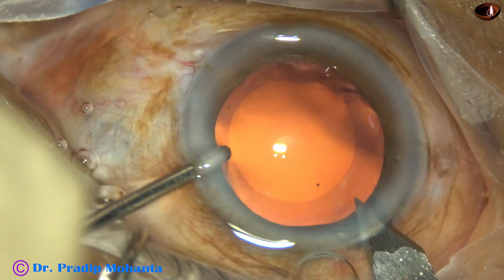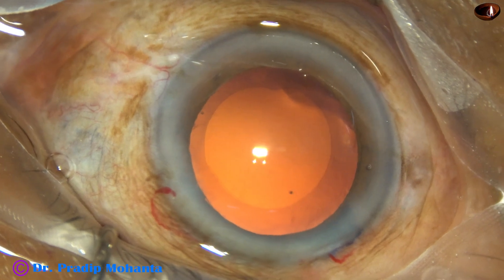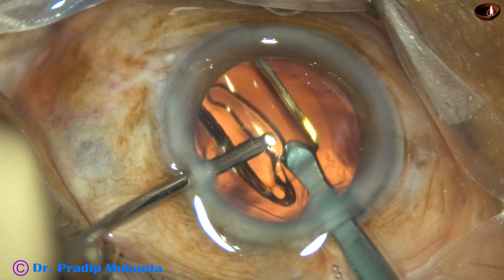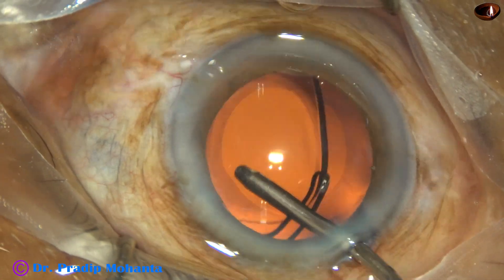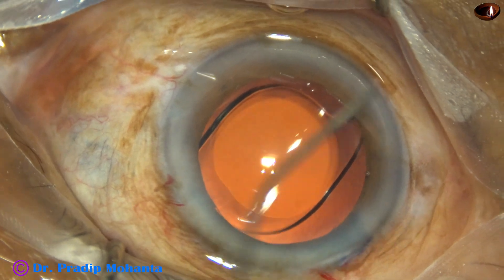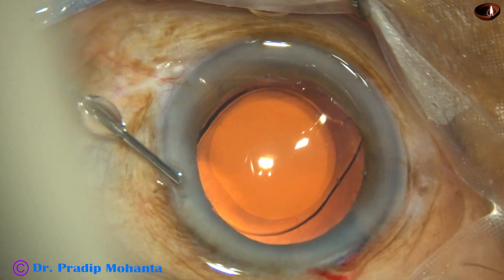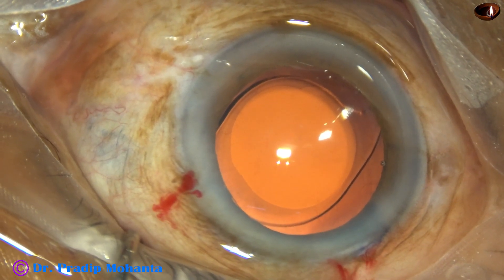And now is the time to implant the intraocular lens. The main incision is enlarged a little bit so that the cartridge can be easily engaged. This is a B cartridge; the main wound is about 2.9 or 3 millimeters now. Here goes the intraocular lens — this is a hydrophobic, acrylic, single-piece, monofocal, aspheric intraocular lens. We can see that the optic of the intraocular lens is nicely covered all around by the anterior capsular rim, so the size of this rhexis is about 5 to 5.25 millimeters.